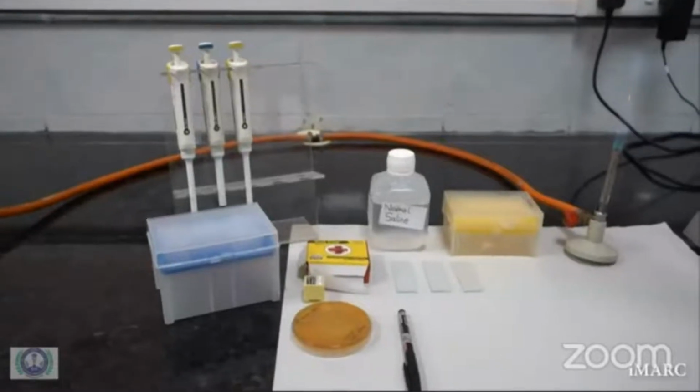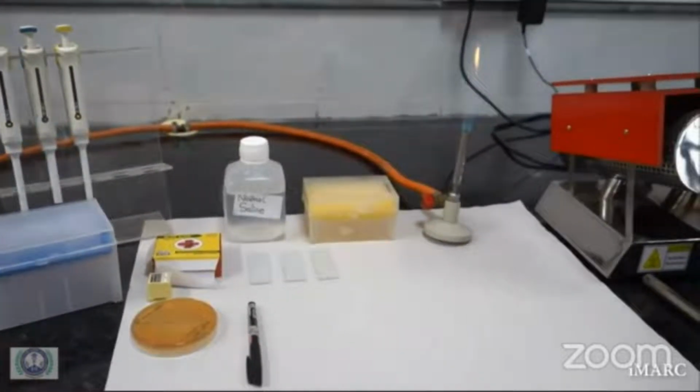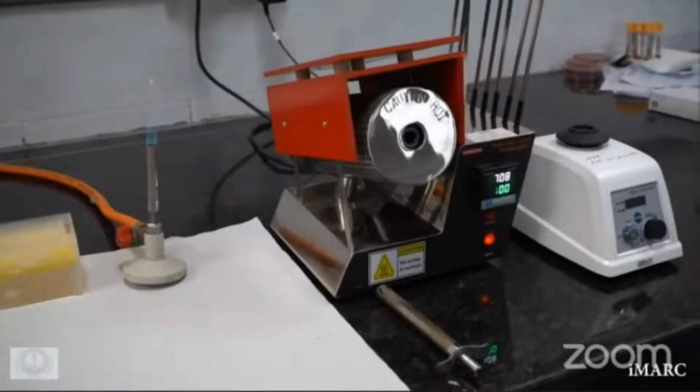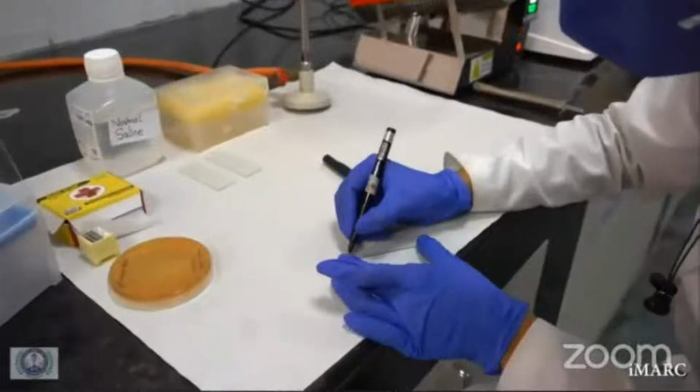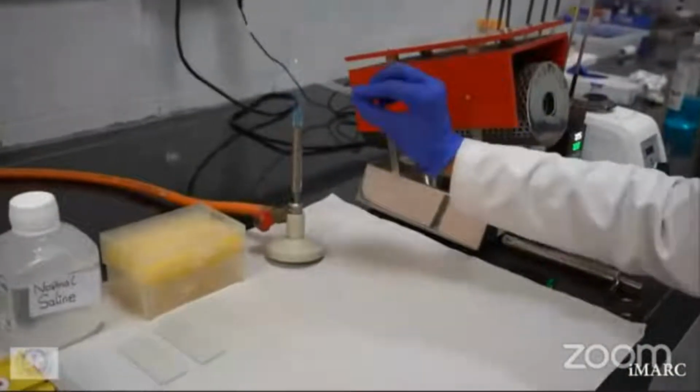Good evening to all. This is Dr. Anish, resident from the Department of Microbiology. Today I present the identification flowchart for yeast. The identification of a yeast isolate begins with a gram stain. The gram stain that we follow is a modified version of Hucker's.